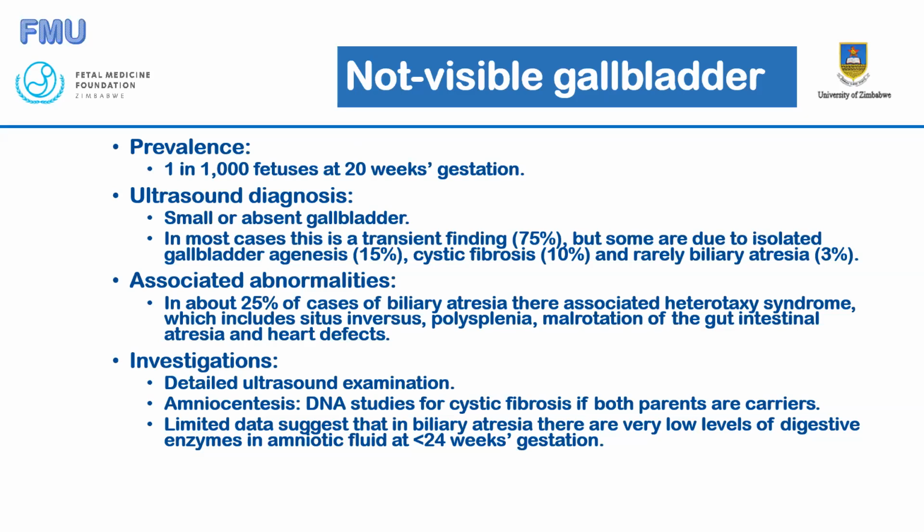So bringing the patient back is quite normal in our work, because organs like the stomach and the gallbladder empty. So sometimes you may not see a stomach because it has emptied, or the stomach may appear smaller than it should because it has just emptied. So it is normal to bring somebody back and say, please come back again so that I can see if the stomach or the gallbladder is there. If you don't see it, then in that case, it's likely that the gallbladder is missing or there are problems.